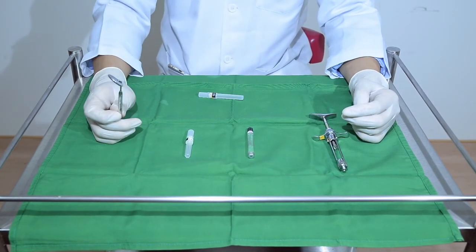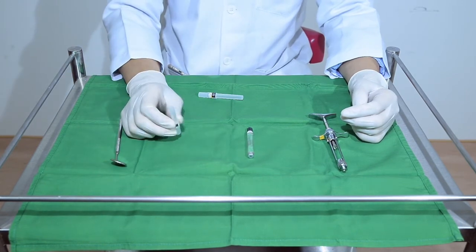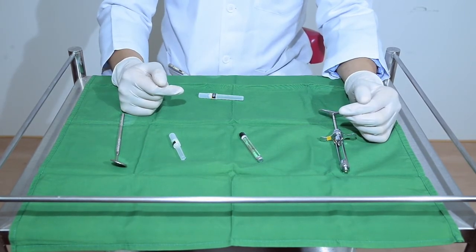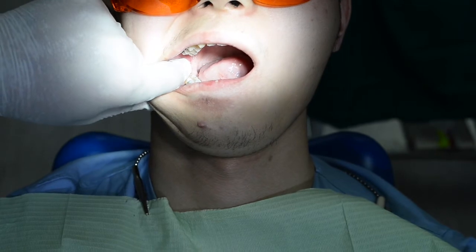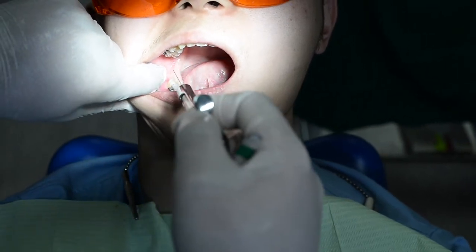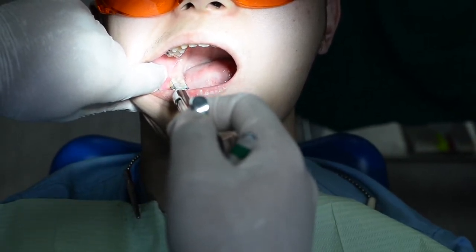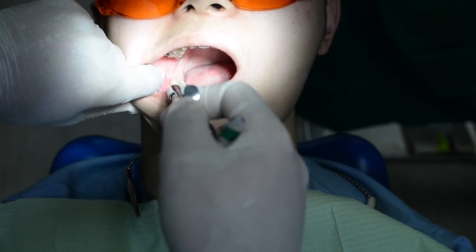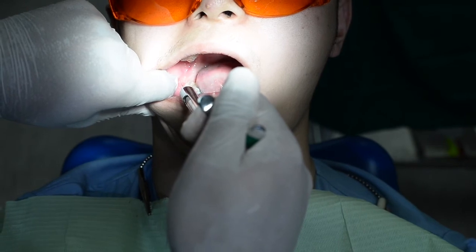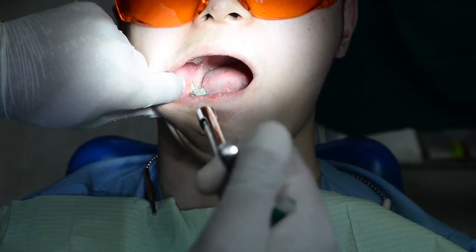Next is the long buccal nerve block. Instruments include a mouth mirror, a short needle, a cartridge of LA, and the syringe. In most cases, the long buccal nerve block is given together with the inferior alveolar nerve block, so a long needle is used. For the demonstration, the operator uses the index finger to stretch and retract the soft tissue. The needle is positioned distal to the distobuccal cusp of the last tooth and parallel to the posterior teeth, then inserted until bone is touched, and about a quarter of the cartridge is injected.